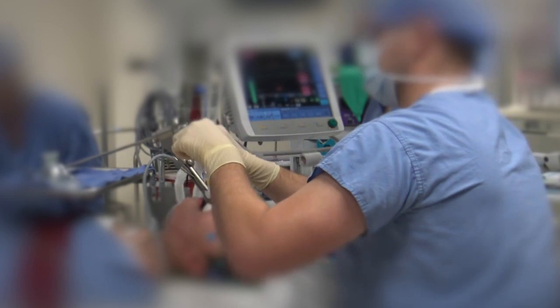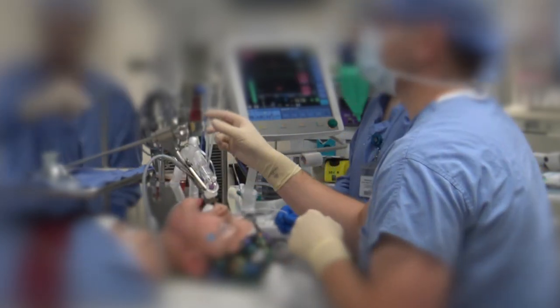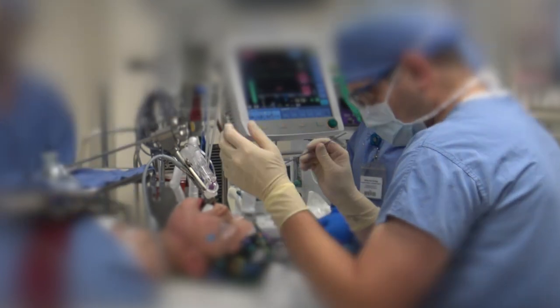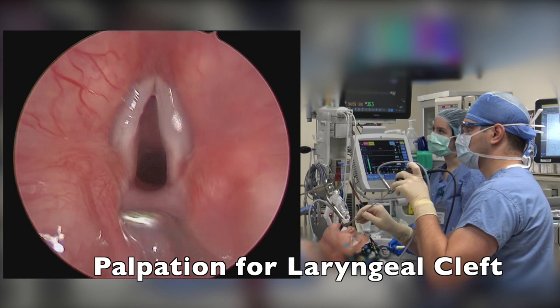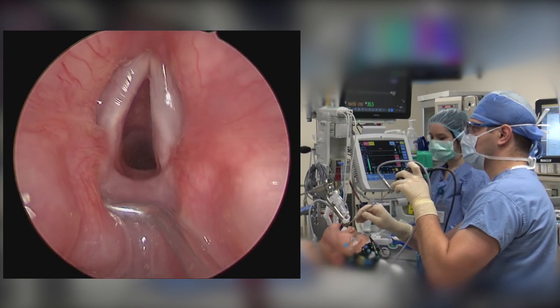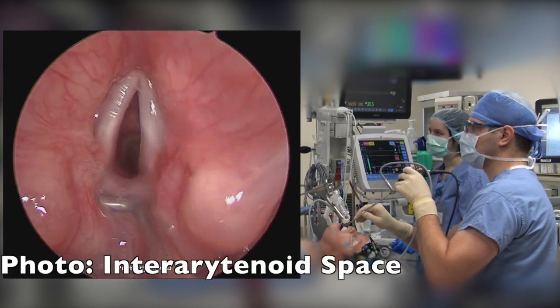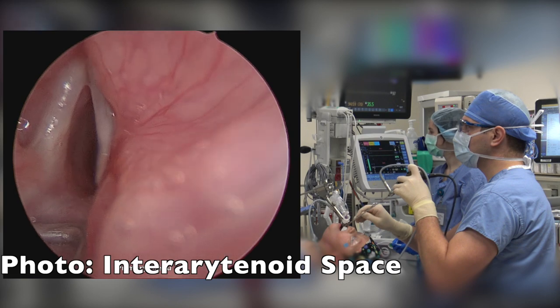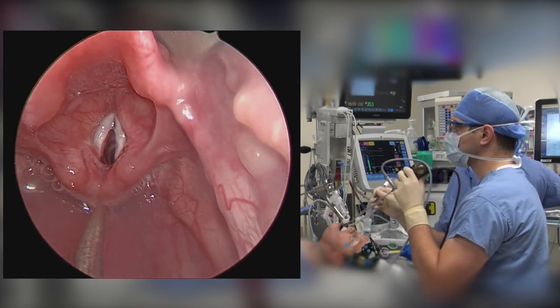The patient is still maintaining spontaneous respiration. An instrument called a right angle probe is used to examine the larynx and palpate for a laryngeal cleft. That's shown here palpating the top of the cricoid and to check the depth of the interarytenoid tissue.